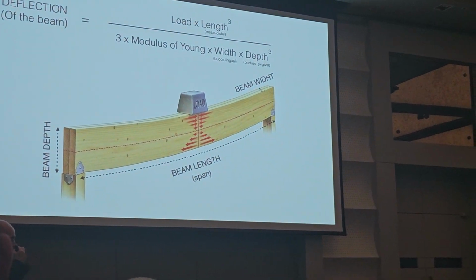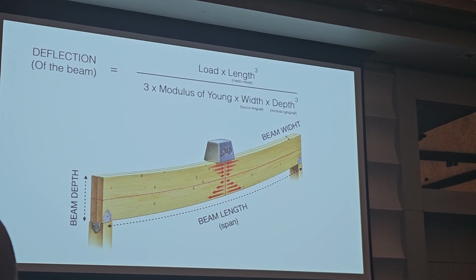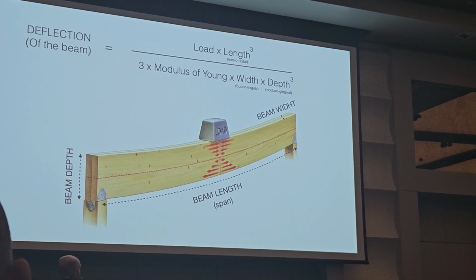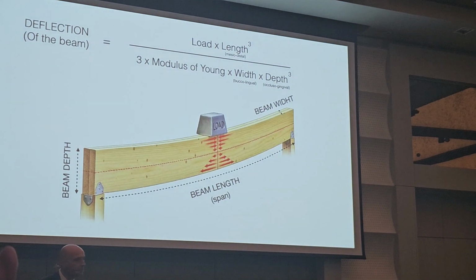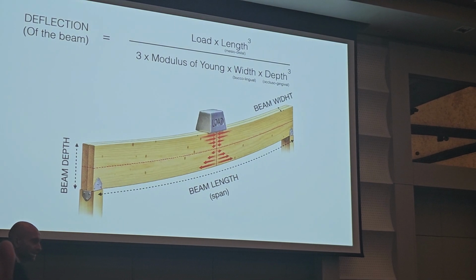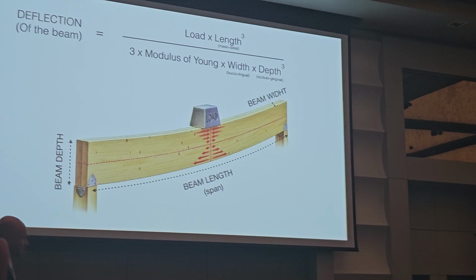You know, zirconia breaks for one reason. The technician doesn't understand. When you have a span, the span flexes according to some parameters. One is the length, but the cube of the length. So it means that if you double the span, the flexion increases 8 times.